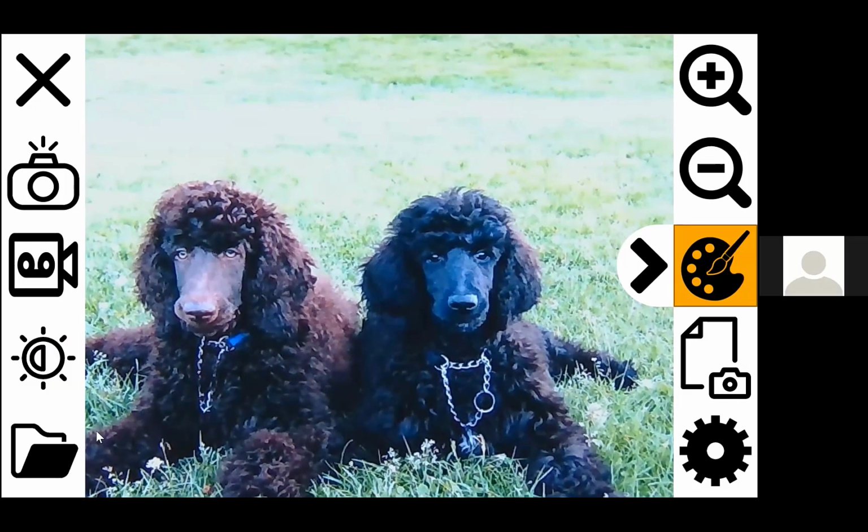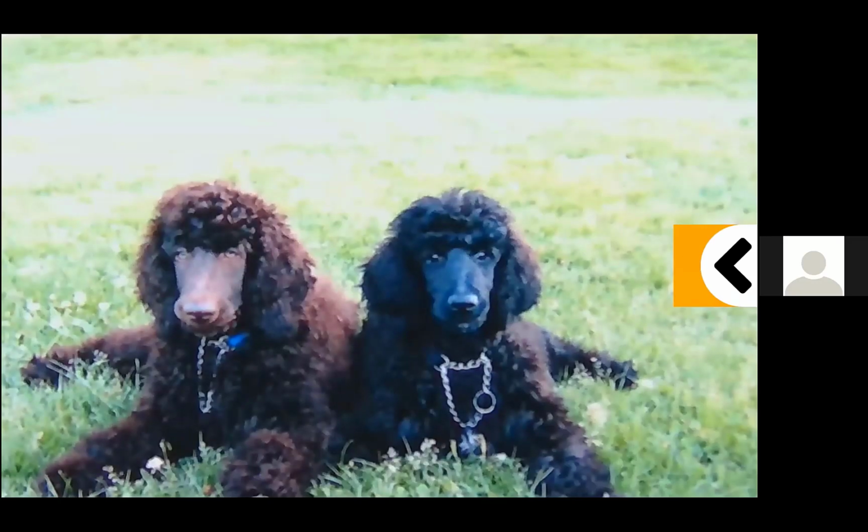And then if you want to access any of your saved documents, so if I want to take a snapshot of this, I can take a snapshot of this. So again, that's the camera. You heard a little shutter sound there. And this is just an image. So there's no text on this. If it were text, which I'll show you in a second, I can actually click on this little icon here of the man with his voice, and that would scan it and read it. But now if I want to save this, I just click on the little disc down here to save, and it's now saved. Come up here and click on my X to exit out of that. And it's going to bring me back to my live view.